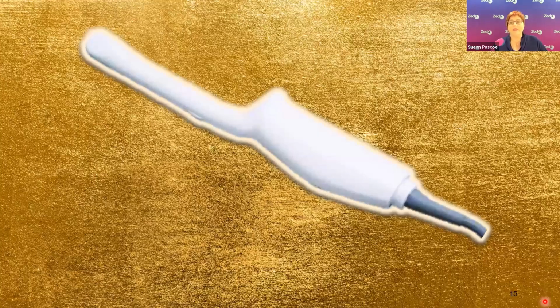Now, the important thing about these pregnancy failure criteria is that the measurements are based on images acquired in a transvaginal scan. The reason is that we get much better detail of the early structures of pregnancy transvaginally. The probe has a higher frequency, so better resolution, and we're putting the probe right up against the anatomy, so we get much, much clearer pictures.